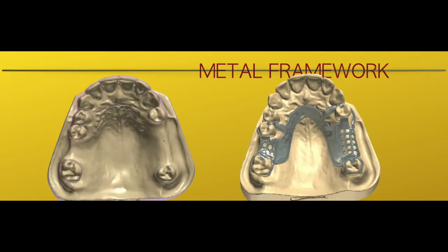One of the clear differences between making a complete denture versus a partial denture is that a partial denture does require a metal framework for structural integrity and rigidity. As shown, this maxillary cast is partially edentulous, and today we're going to discuss about the five components needed to design the metal framework.